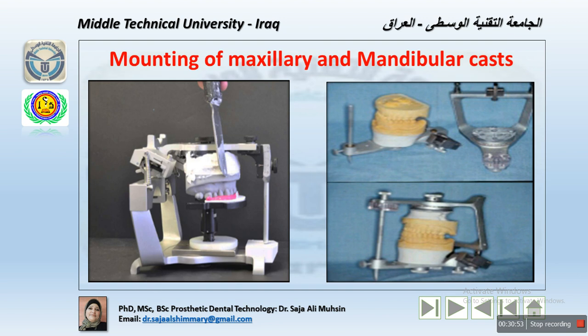Okay, if we are using a magnet or a screwed plate with the articulator, we should keep in mind to lubricate the slots or most of the details of these rings with a little bit of petroleum gel to make sure it will be easily demounted when later on we are preparing for flasking. Okay, now the maxillary cast is placed onto the record base of the occlusal rim.